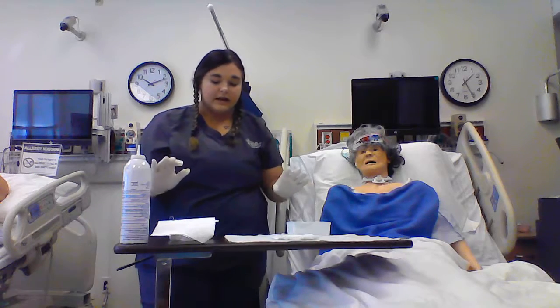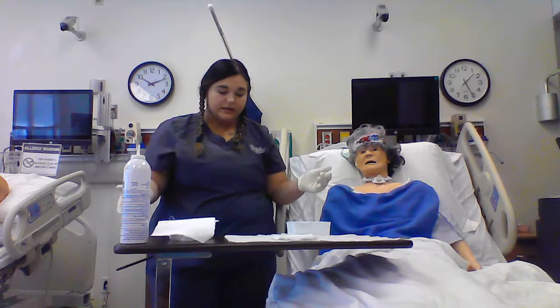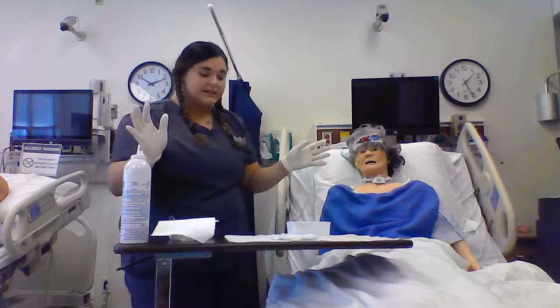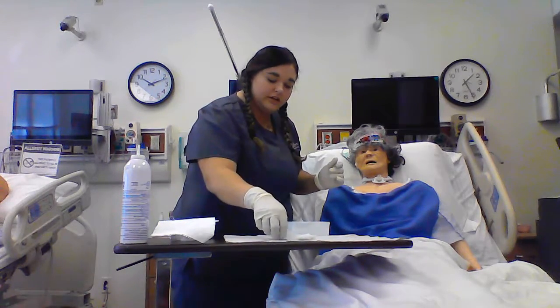For the video's sake, I'm not going to don a new pair of sterile gloves. However, at this point, I would don a new pair of sterile gloves to replace the V-sponge, which is the next step. So at this step, I'm now sterile. I'm going to replace the V-sponge on my patient underneath her cannula here.